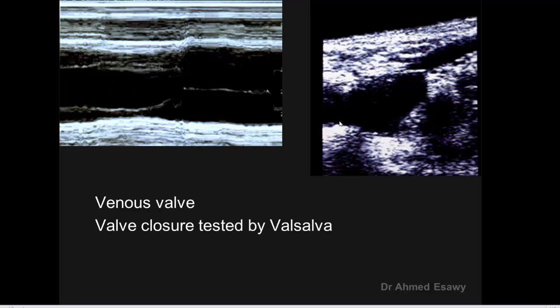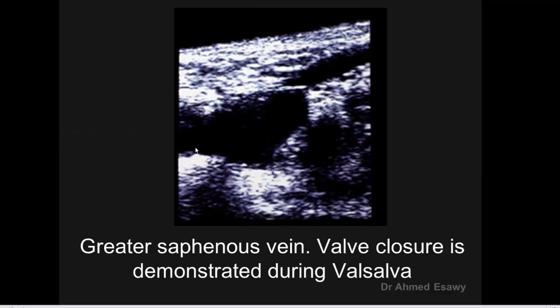Valve closure during Valsalva normally prevents reflux of blood in the opposite direction down the leg. Greater saphenous vein valve closure during Valsalva prevents saphenofemoral junction reflux. This confirms great saphenous vein competency with a healthy, closed valve.